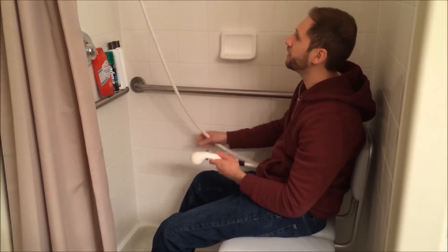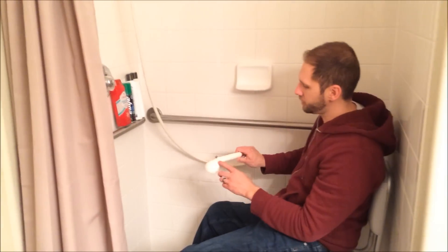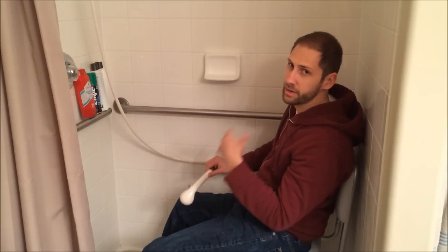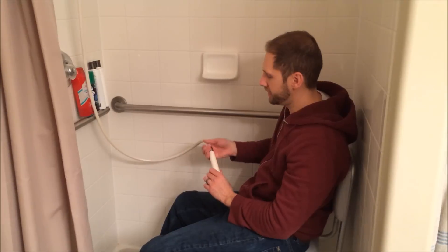This is really nice — it's a longer extended shower hose for somebody that's sitting down in a wheelchair. It also has a shut-off valve right here, so once I get wet, I can turn it off and do the soap and everything like that. This thing's not spinning around all over the place, so that's kind of nice.